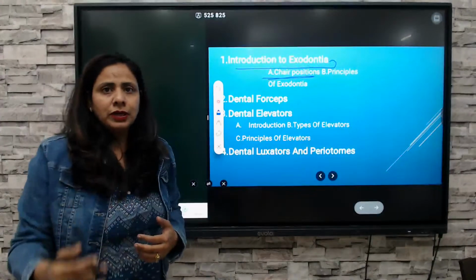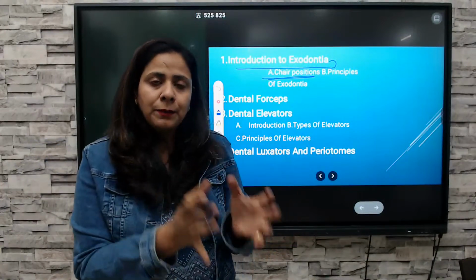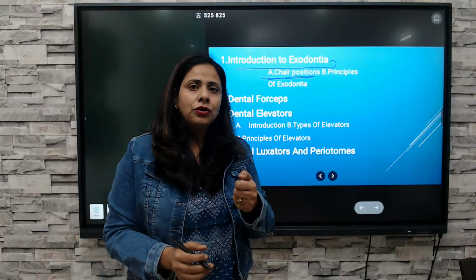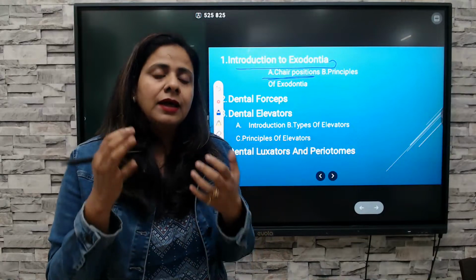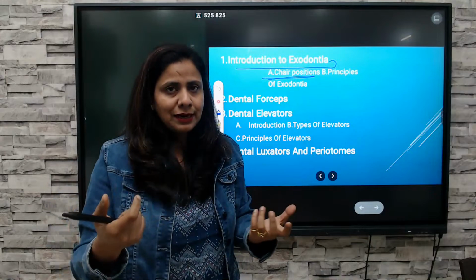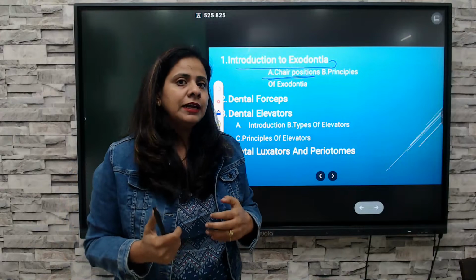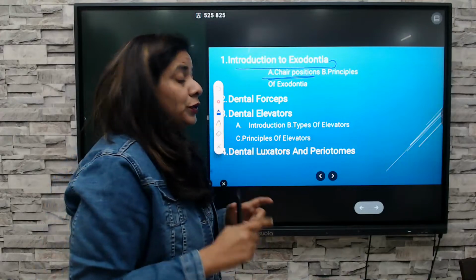Whenever we are doing extractions, it is very important that we keep the chair at a particular position so that your arms and body are not tired. Also, during the extraction, there are a lot of movements happening. If you're not doing those movements properly, there is a possibility that you might fracture the tooth. So we do not want that.